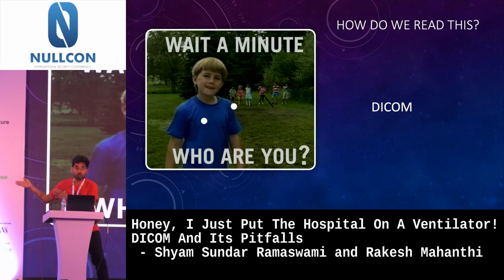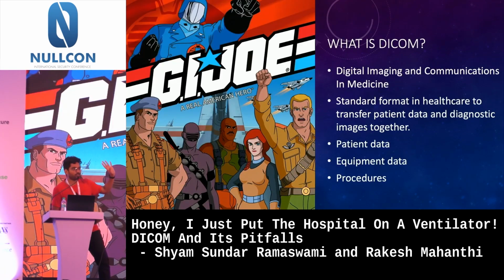So Rakesh will probably come and talk later about the internals of things. But it's a fair bit of introduction. Now, how many of you watched G.I. Joe in the past? Sorry, I come from a very old school background. I absolutely don't know what G.I. Joe means, but I know what DICOM means. Digital Imaging and Communications in Medicine.